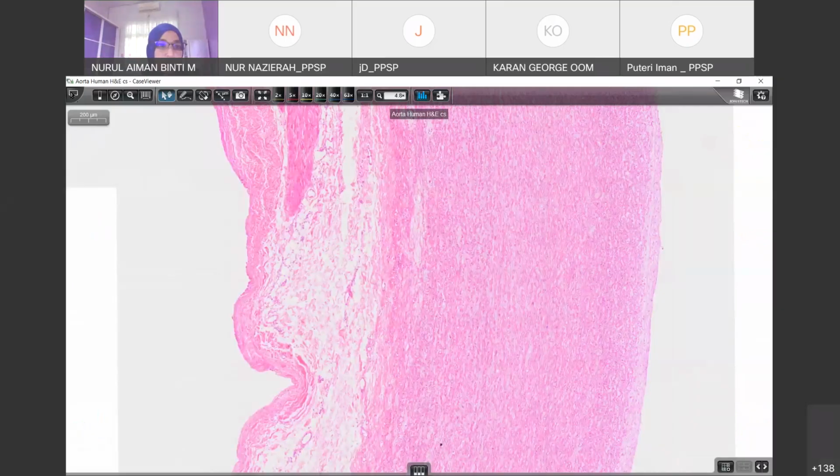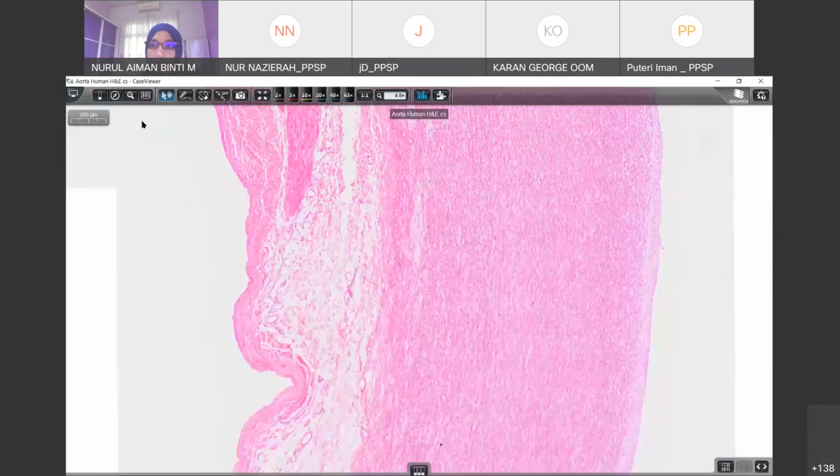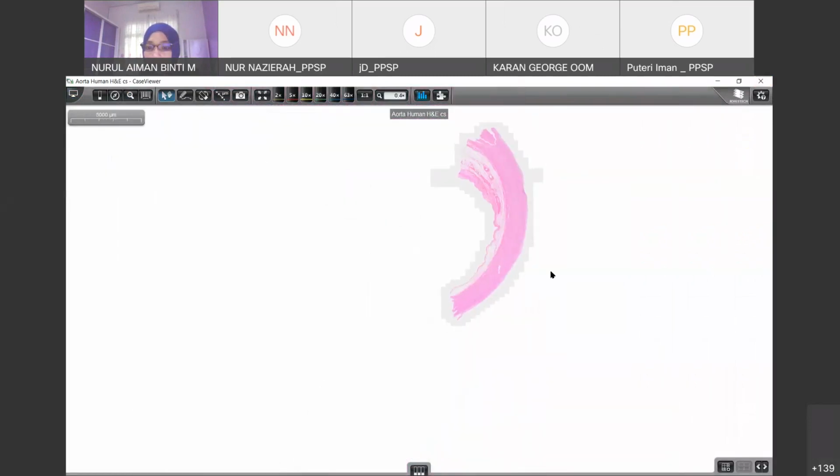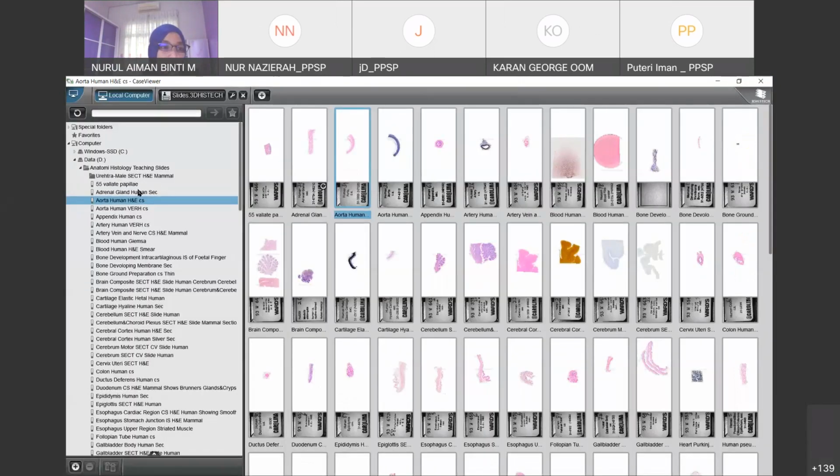So we go to the other slide. I need to close this first. How do I close? Okay, then the next slide.